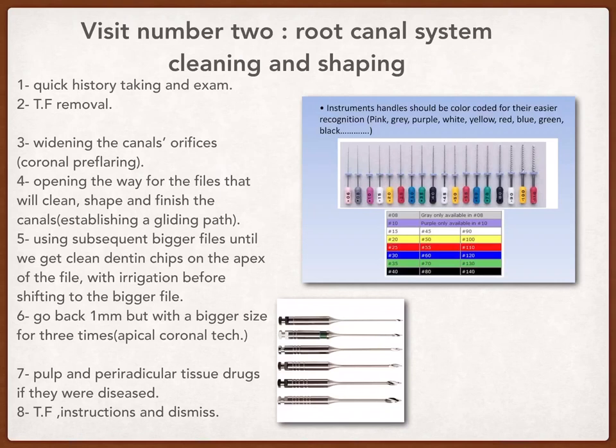And at that point, the apical third of the root canal is clean, and then we can go back 1 millimeter but with a bigger size for 3 times.